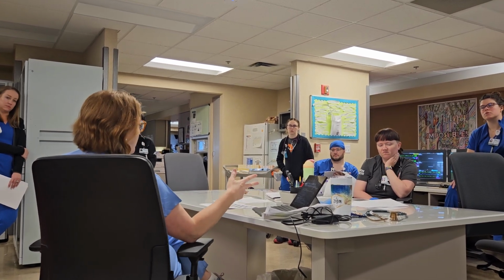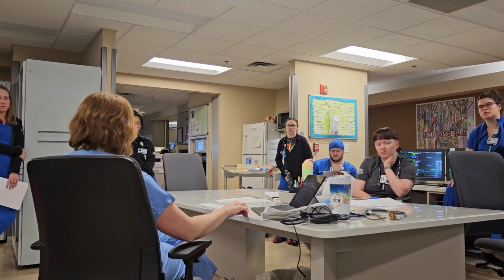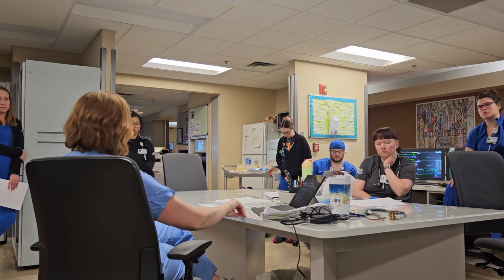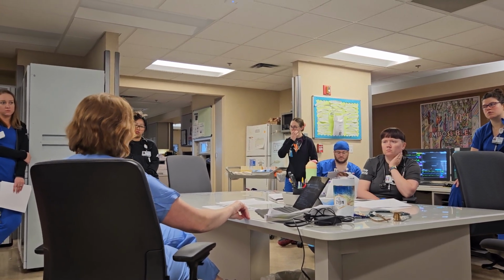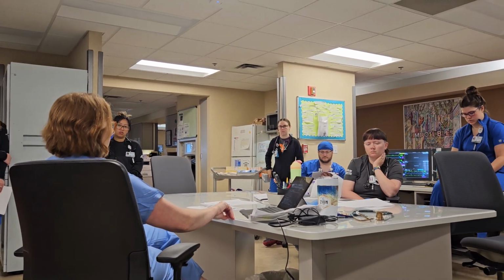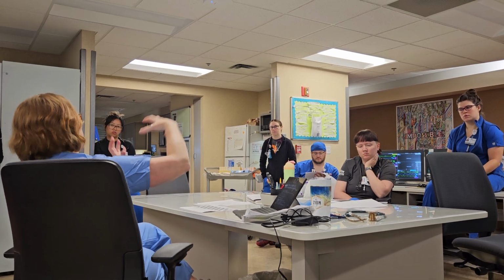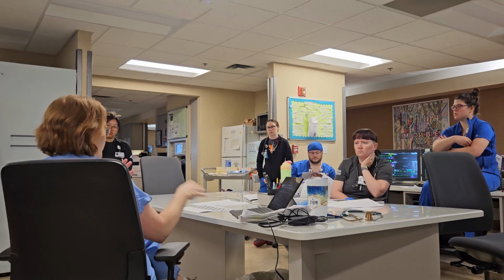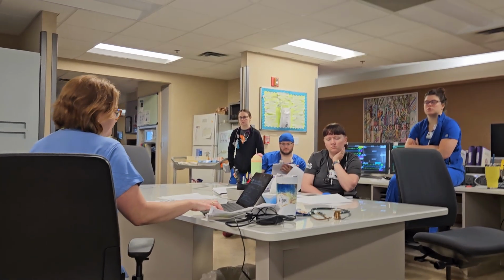So our target tidal volumes now are typically 6 to 8. 8 I'd say is average, 7 to 8 you see a lot of. 6 is a much smaller tidal volume. We typically use that in patients that have real ARDS or have a lung compliance issue where we're not wanting to target large volumes to create higher airway pressures. And it's based on ideal body weight, not their actual weight. Ideal body weight is calculated off of their height.